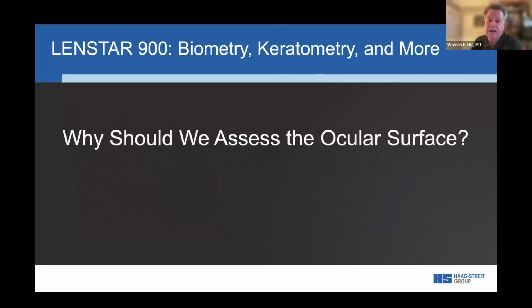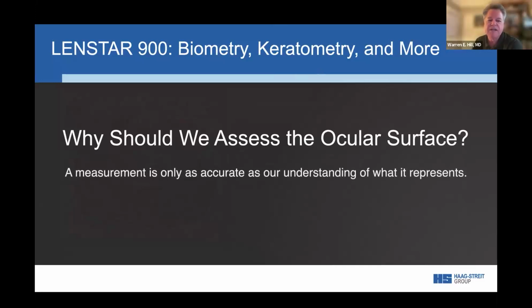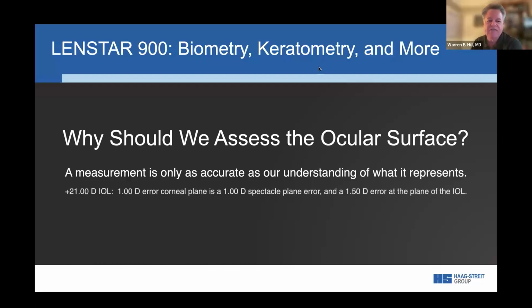And why should we assess the ocular surface? Well, when we do keratometry, we're looking at reflected light. And a truer statement has never been said: a measurement is only as accurate as our understanding of what it represents. You want to get out of the habit of just pushing buttons and accepting everything at face value.